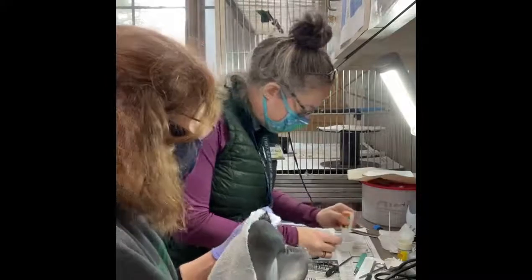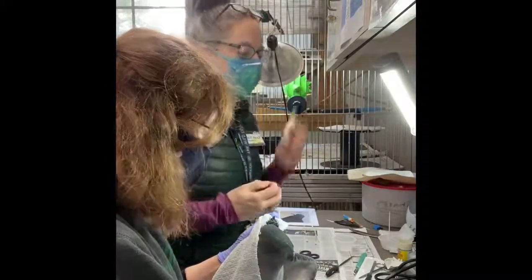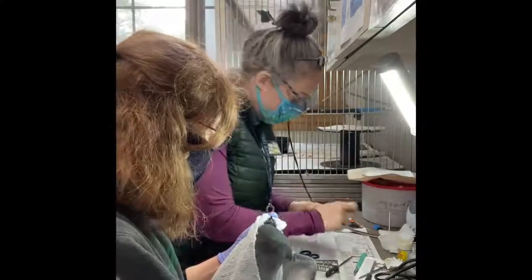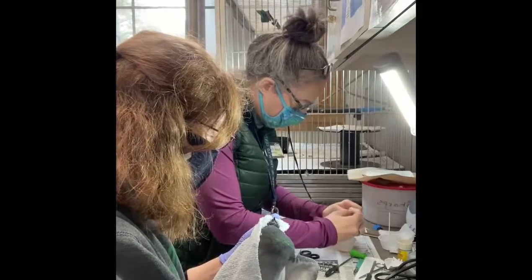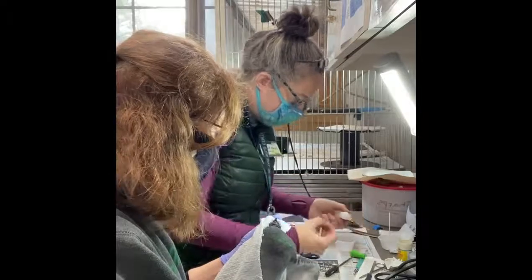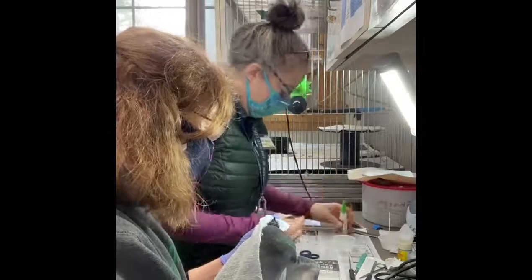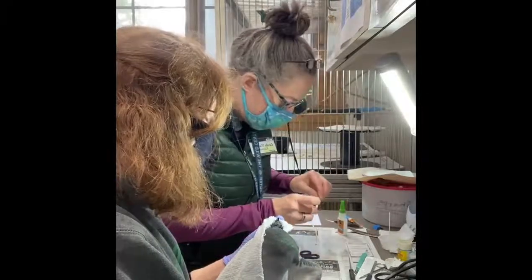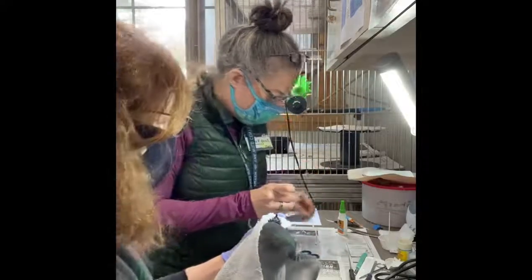I'm going to try to put some glue in here. I definitely prefer the gel — it's easier to work with. It's going to get all over my hands anyway.